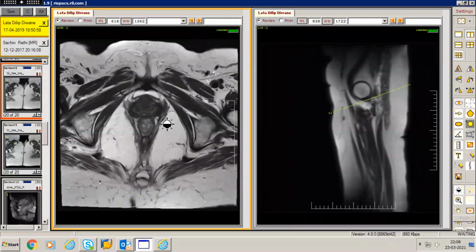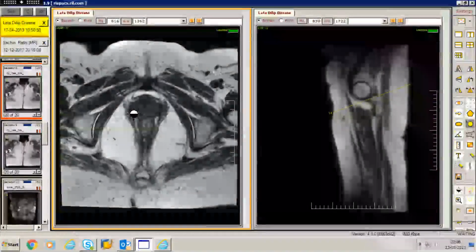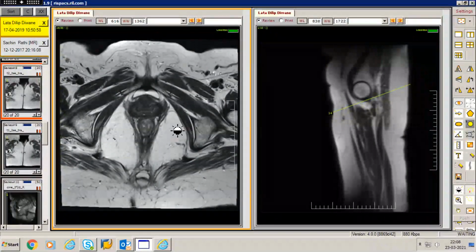One small tip which I can add on how to identify endopelvic fascial injury, from anterior to posterior, is that you can identify it in a pretty easy way. Remember the normal configuration of the vagina, which is usually what I call an H-shaped structure. You would see it symmetrically going up here, the two limbs, and then you would see the slit-like structure which hangs out here. That's a typical vagina which you're used to seeing.